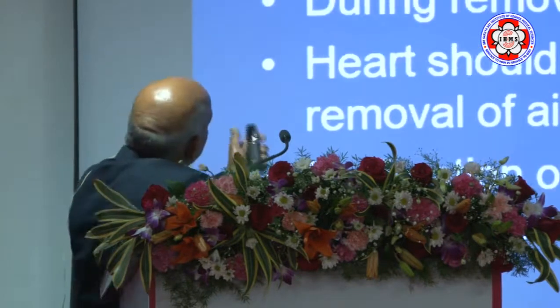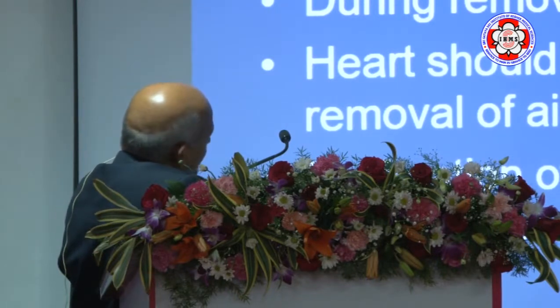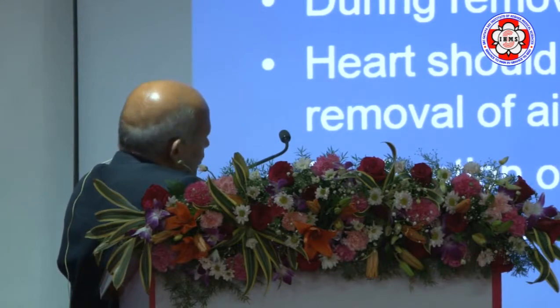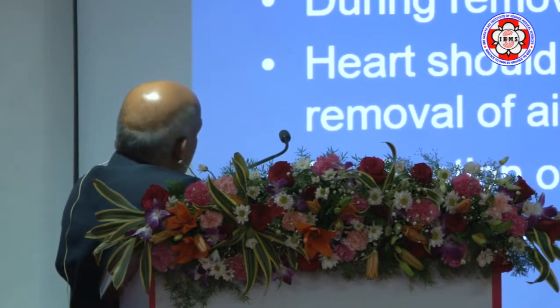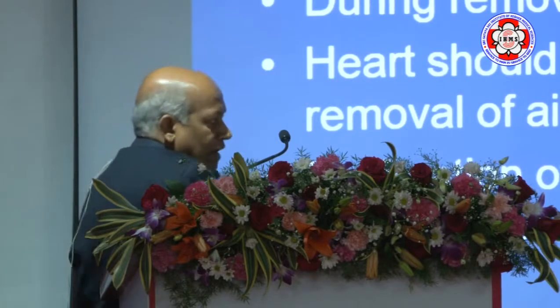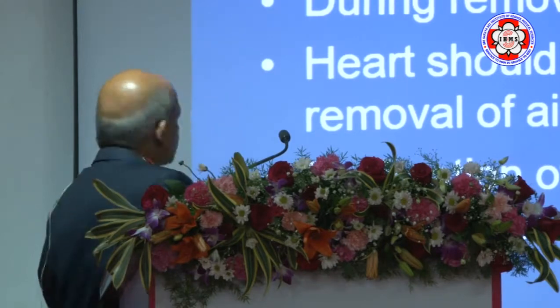Rupture of the LV wall is rare, but a fatal complication. It happens from too much traction on the annulus, excising the mitral valve, implanting too large a valve or prosthesis, and removal of calcium on the posterior annulus can also cause LV wall rupture. I had a couple of those, but was able to repair it with a pericardial patch and put in a valve. There were no catastrophes, but I recognized the tear.